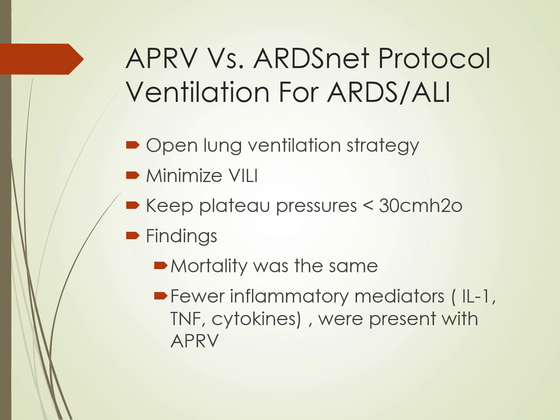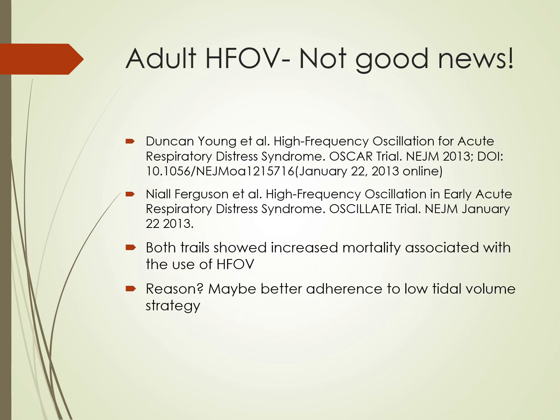Something to think about. I am sure you all have heard of the high-frequency oscillator. The high-frequency oscillator ventilator has been a heaven-sent tool for the babies. It actually has improved mortality and it's done wonders. So they tried to use the adult high-frequency oscillator with patients with ARDS.